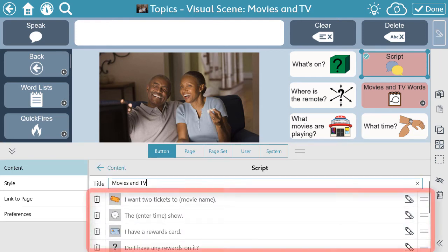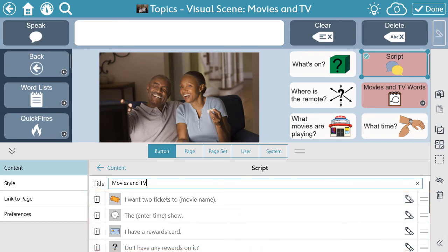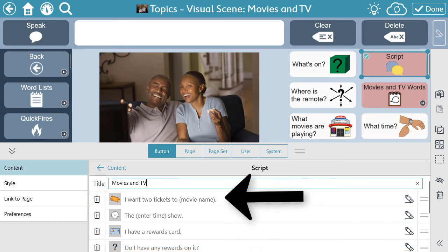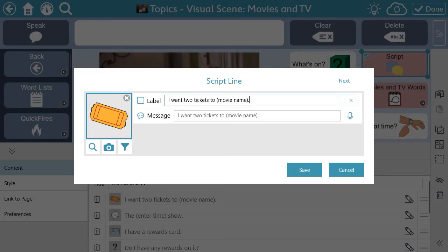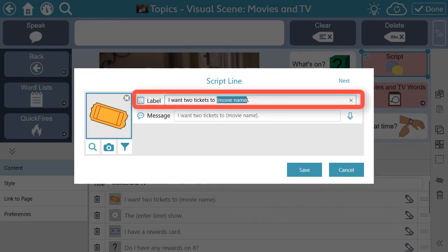Here, we can see each line of the script laid out. Select a line of the script, add the missing information, or edit the script completely to better fit your needs.